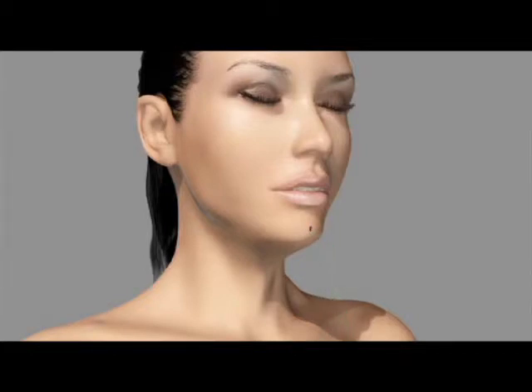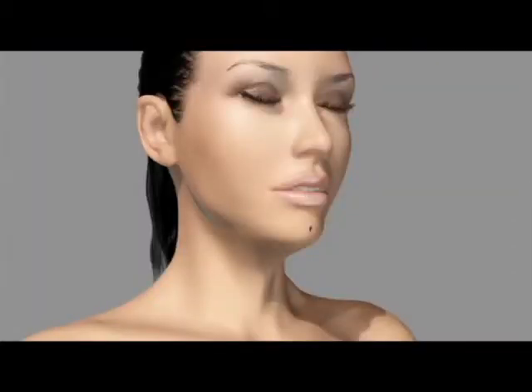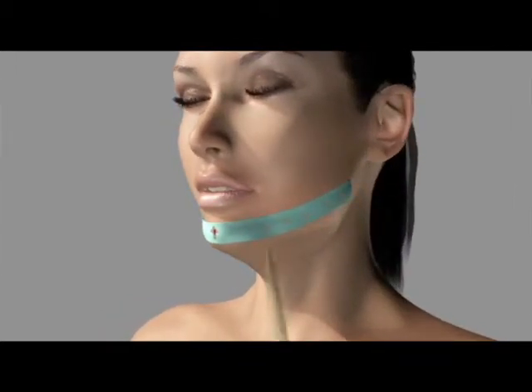The trampoline platysmoplasty is then placed after the neck-defining suture. This illustrates the tape that is used and placed along the jawline. This is included in the iGuide surgical suture system. As you'll note, there are alternating lines and dots. These are stenciled out from a point extending anteriorly to a point posteriorly, just at the posterior aspect of the angle of the mandible. The reason there are alternating lines and dots is that during the weaving of the suture matrix, this allows the surgeon to go to every other dot just as you would if you were lacing a shoe one lace at a time.